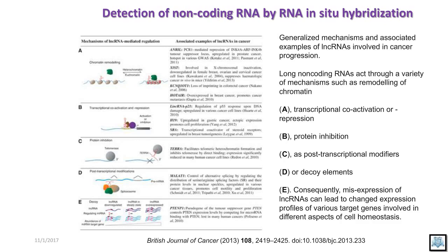I think when these drugs reach the clinic, when they have therapeutic potential, the approach that I described, the combined IHC and RNA-ISH, will be a powerful approach for the early diagnosis of the needle biopsy or the prostate metastatic biopsy, for characterization of these tumors for the presence or absence of these molecular markers, which is a very powerful approach.